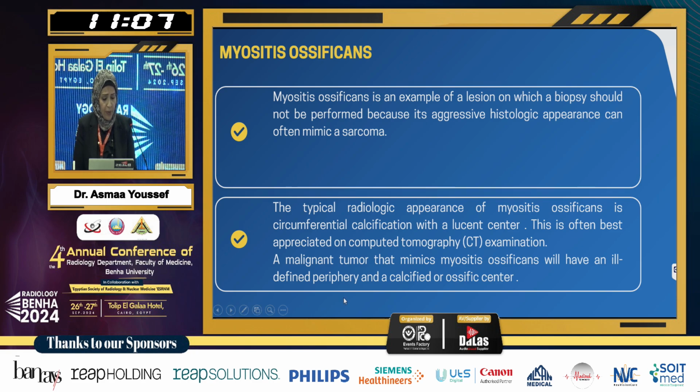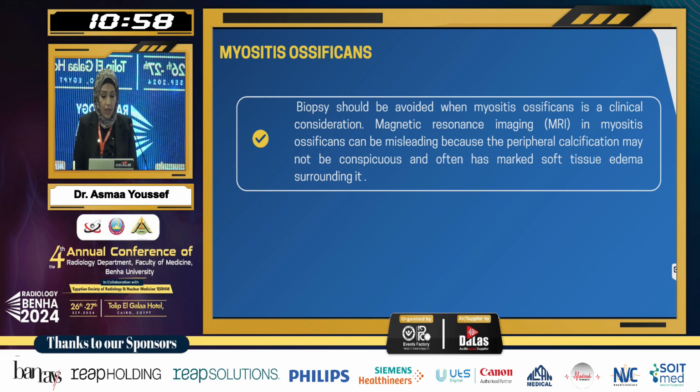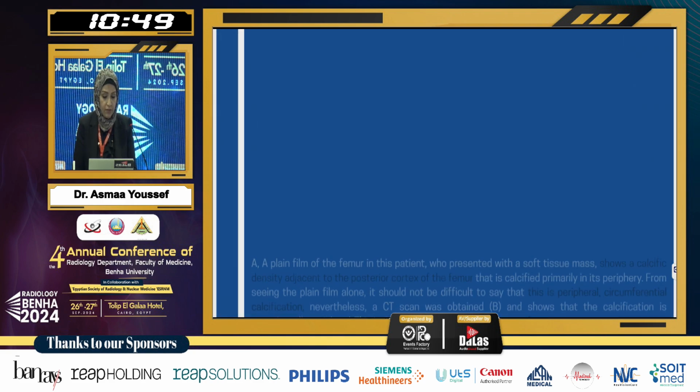This is often best appreciated on CT examination. A malignant tumor that mimics myositis ossificans will have an ill-defined periphery and a calcific or ossific center. So biopsy, as we said, should be avoided, and MRI is misleading because peripheral calcification may not be conspicuous and often there is marked soft tissue edema surrounding it.